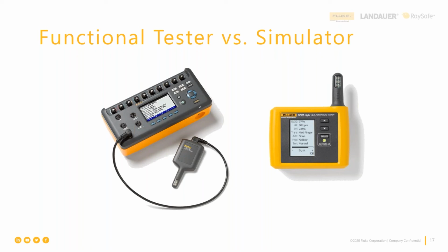Does that mean it's not valuable or effective in determining the proper performance of a pulse oximeter, whether it's built into a patient monitor or standalone? No, it is perfectly fine to have a functional test. But remember that it's all got to be based on the R curve. And so you have to have the proper R curve for each brand and model of pulse oximeter that you're going to test. One size does not fit all.